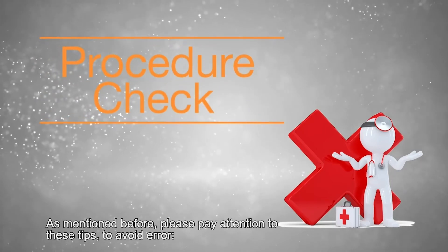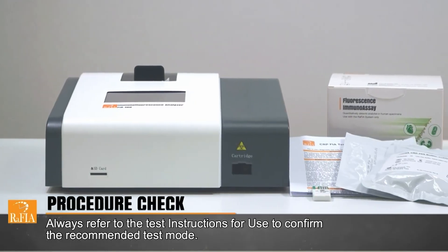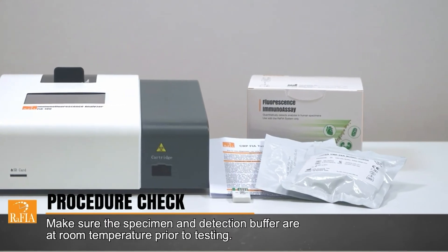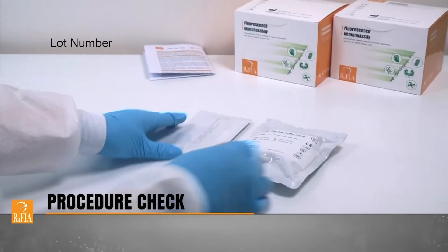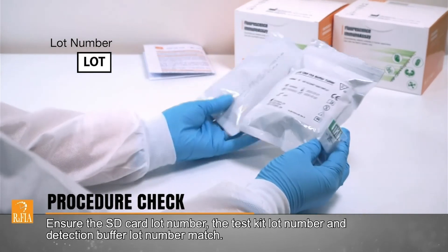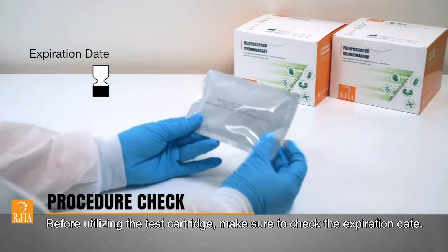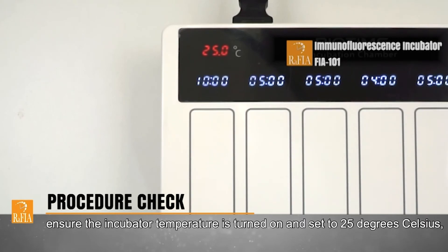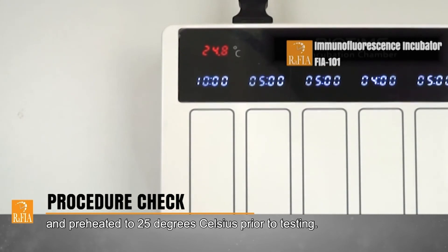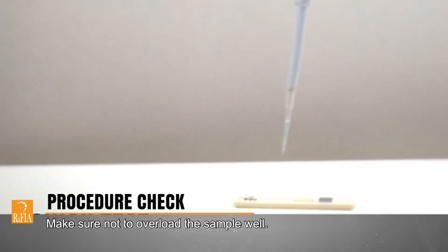Please pay attention to these tips to avoid error. Always refer to the test instructions for use to confirm the recommended test mode. Make sure the specimen and detection buffer are at room temperature prior to testing. Ensure the SD card lot number, the test lot number, and detection buffer lot number match. Before utilizing the test cartridge, make sure to check the expiration date. If using quick test mode, ensure the incubator temperature is turned on and set to 25 degrees Celsius and preheated to 25 degrees Celsius prior to testing. Make sure not to overload the sample well.